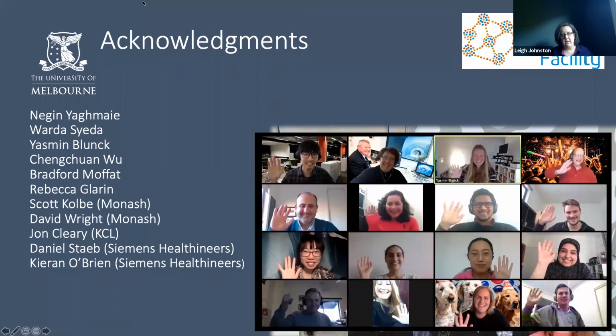So the multi-echo data is great in that sense. It's certainly not everything that you would want. There's some other work that I didn't present today. I don't know if you've heard of FLAIR imaging, but it's essentially putting a 180 inversion on the front of a standard imaging sequence, not like MP2RAGE. It nulls the fluid signal in a standard image, so that everything else stands out. You'd think that could just be done by image processing, but it really can't. It nulls the fluid signal that you get from the CSF, the cerebrospinal fluid, and the contrast in the tissues is much better with a FLAIR image.